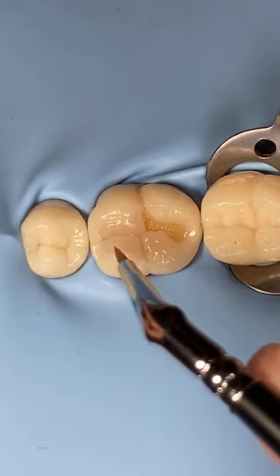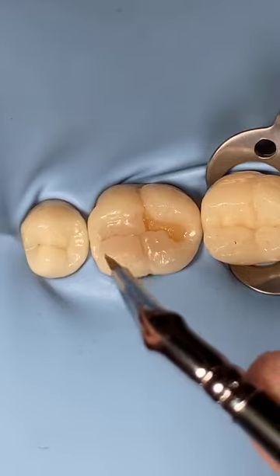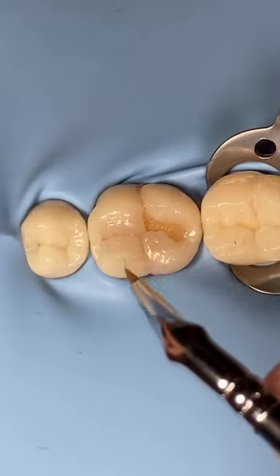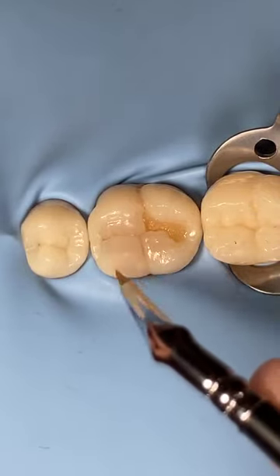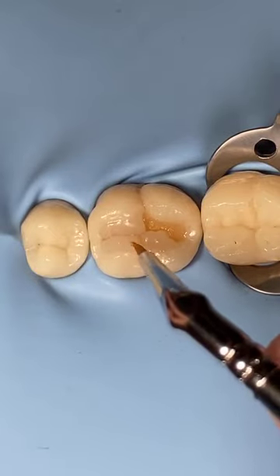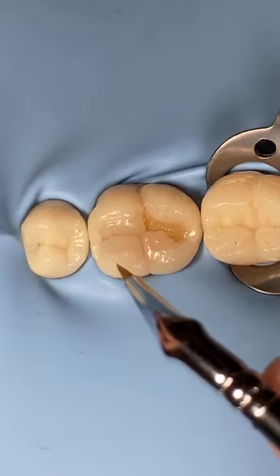And I repeat, if you have magnification, it's way, way easier. So don't hesitate to get your new loupe, to get your microscope, because it will change your dentistry. I bet it really will change your dentistry. That's the biggest investment. Okay.